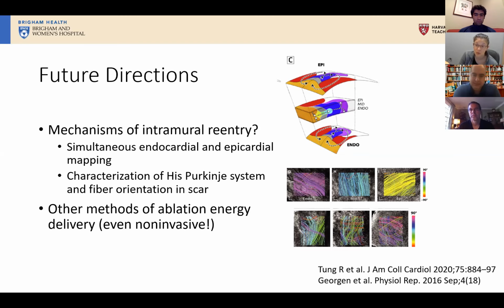But we had one very interesting case of a gentleman with a post-infarct VT. The infarct was very old. He had his infarct when he was 30, and the VT showed up when he was in his 70s. There had been a huge amount of fatty metaplasia of the infarct, and we couldn't deliver good RF energy into the scar. With the needle, with anything, we could sometimes get VT termination, and the signals looked great, but we could never get effective persistent block. That patient did extremely well with SBRT. I think that's something where SBRT really outperforms RF ablation on a pretty routine basis.